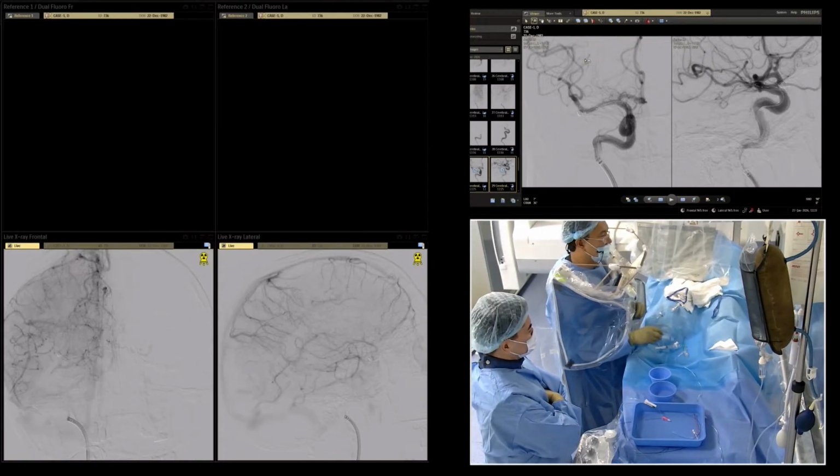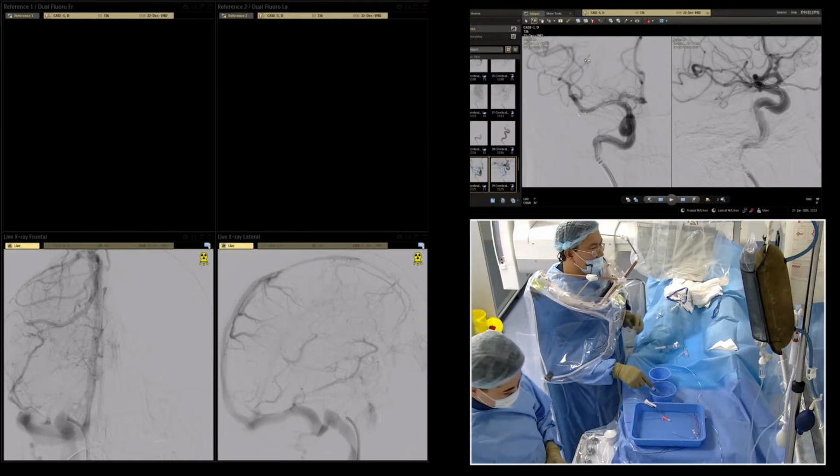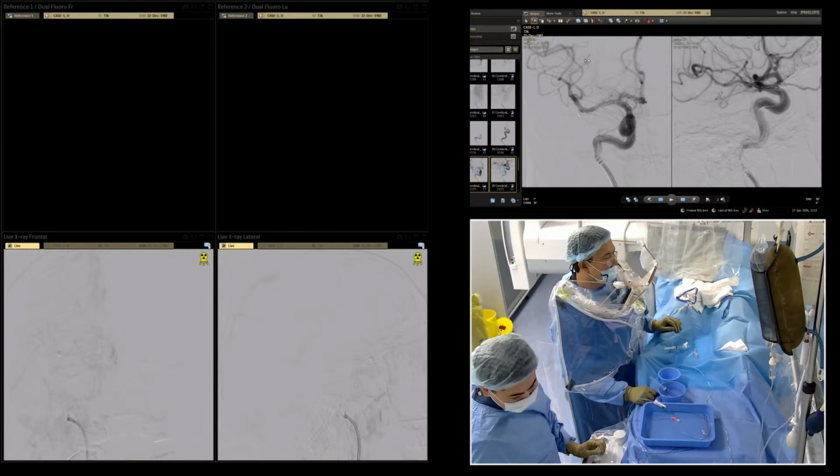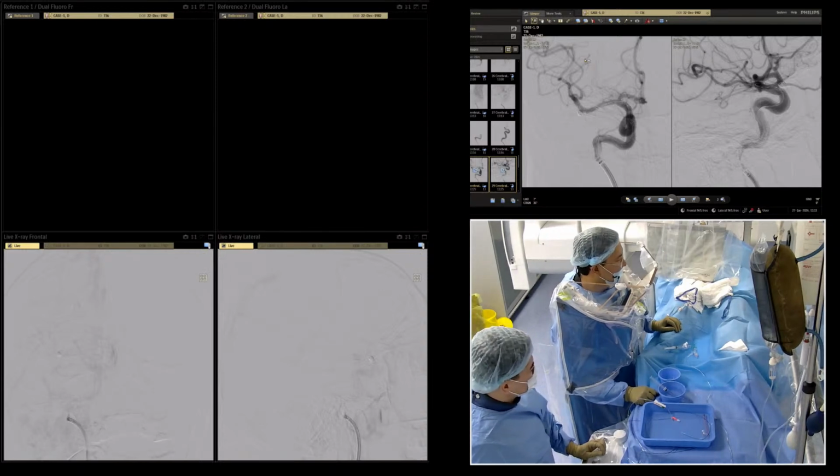But finally it's okay. I think there is no bleeding. Okay, let's check. Let's wait till the end. There is no contrast stagnation. Okay.